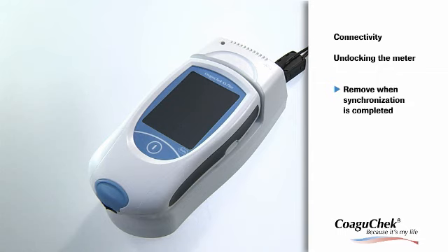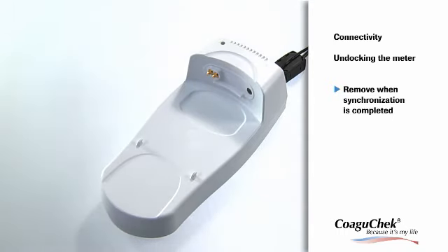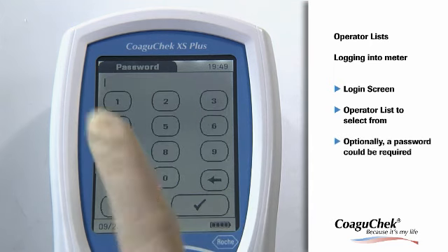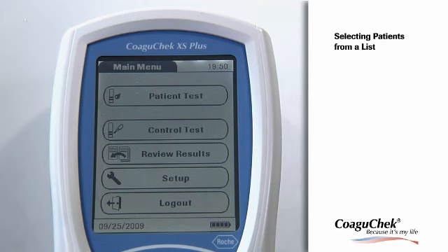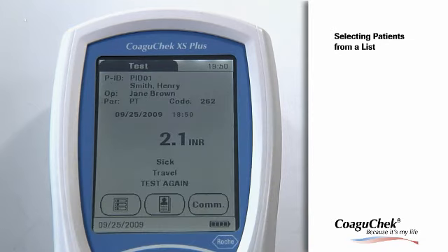The meter can now be undocked. Remove the meter from the HBU, pushing it gently towards the charging contacts until it snaps out of position. The use of the meter may be restricted to operators on a list — this could be displayed on the login screen. The operator selects the ID from the displayed list. If required, the operator may also enter a password to log in. To log out the operator from the meter, a log out button is available in the main menu, which will bring you back to the login screen. In order not to enter every patient's ID manually, there is the option of selecting the ID from a list. After a patient is selected, the new result will be pooled with all other results corresponding to that patient.